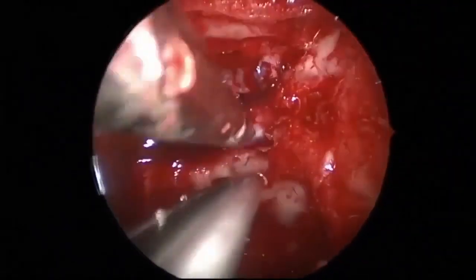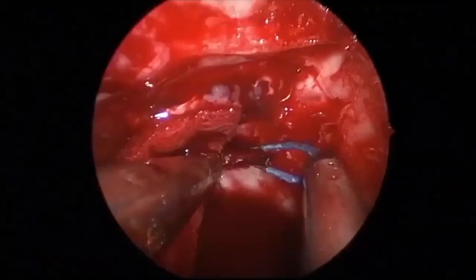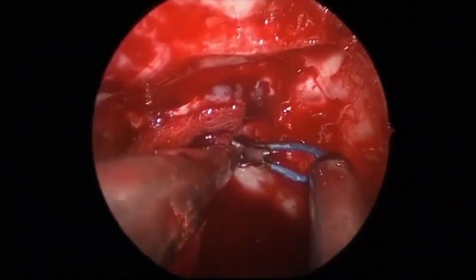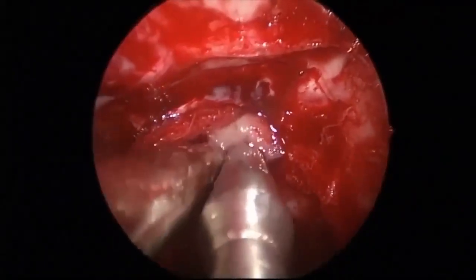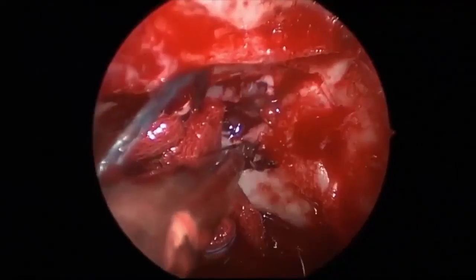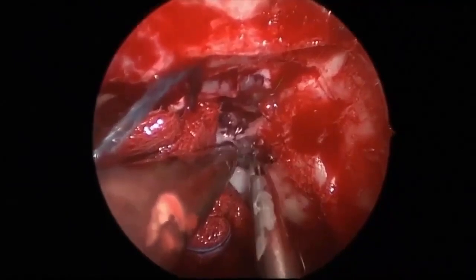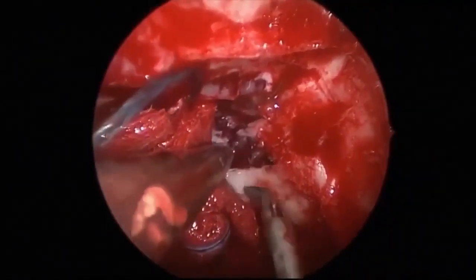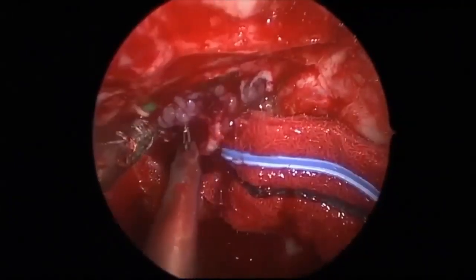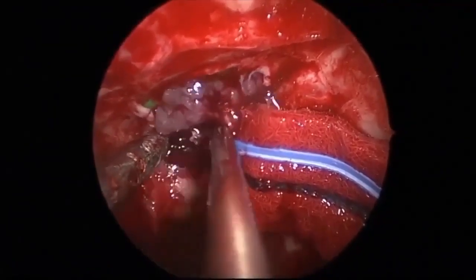At this point, removing the inferior part of the medial OCR that had been inadequately removed. Bipolar is used to cauterize the superior intracavernous sinus on either side. Thrombin-soaked gel foam can be used since there can be extensive bleeding from this area. However, the complete superior intracavernous sinus and diaphragma sella must be opened medial to the carotid artery on either side in order to expose the lateral margins of the tumor.